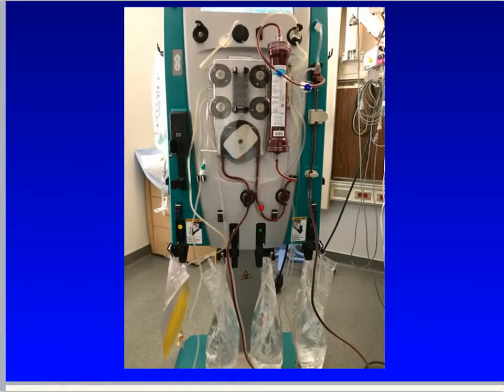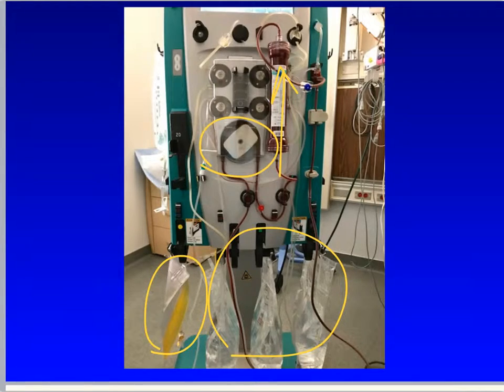Here's how a CVVH machine looks. Again, we have the patient's blood running through the hemofilter, its rate being controlled by a roller pump, and ultrafiltrate is collected in one bag while replacement fluid is infused before and after the hemofilter.